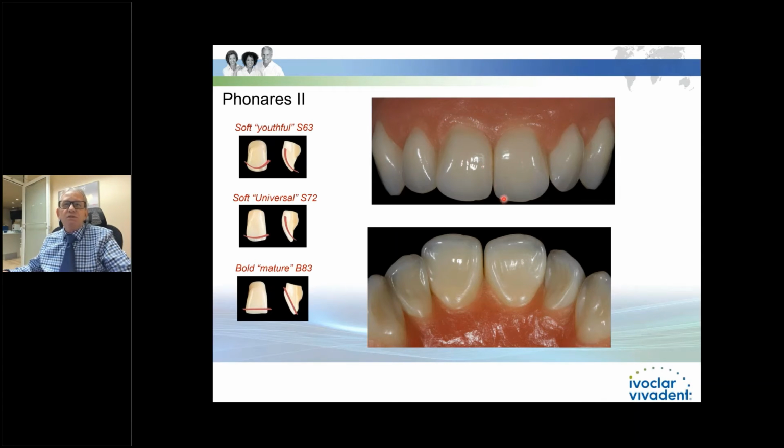And if you look at the labial, look at the incisal. Look at that opalescence. That is exactly where your crown and bridge would make these cases. And so you don't have to have a denture that looks like dentures. This looks very natural. Look at the subtle little embrasure here. What I really like also is we have widened, instead of having this square tapering, square ovoid, or tapering, the teeth have been widened here. So the necks are wide all the way down. But look at that nice interdental papilla there. Look at the emergence profile.